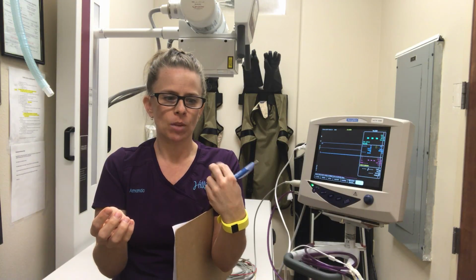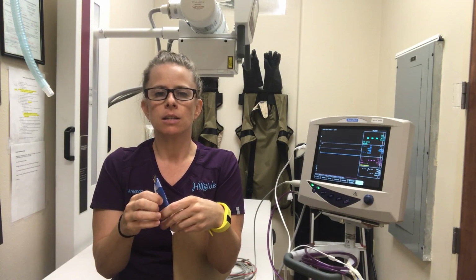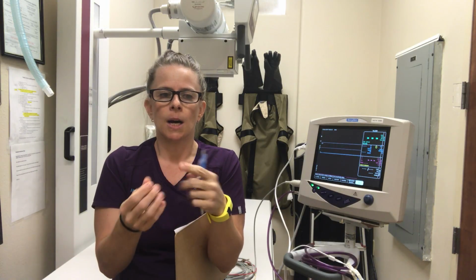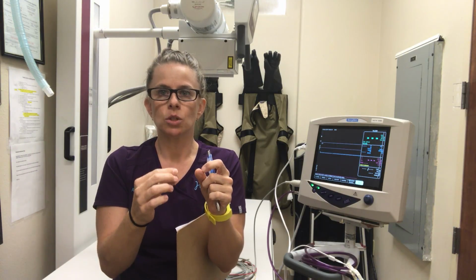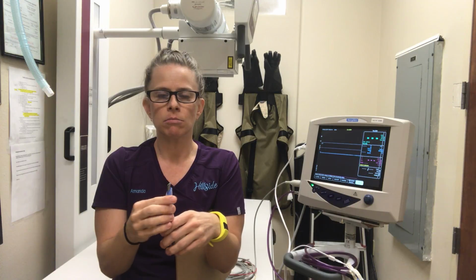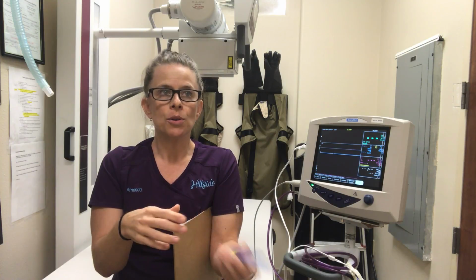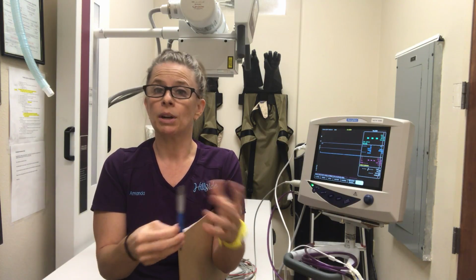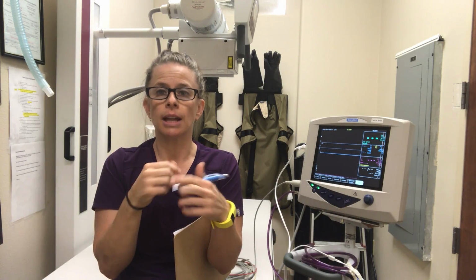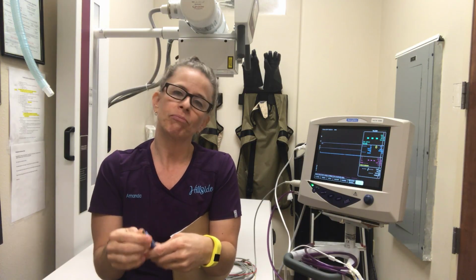There is another reflex, the swallow or laryngeal reflex. You can find it at two different times during intubation: when you start to introduce the tube and the epiglottis slams closed, mostly as a protective mechanism, you can see the patient start to swallow. Also, it's a good indicator when a patient is ready to be extubated. You'll start to see the swallowing at the ventral neck, and that's a good indicator that it is a safe time to go ahead and remove the tube.